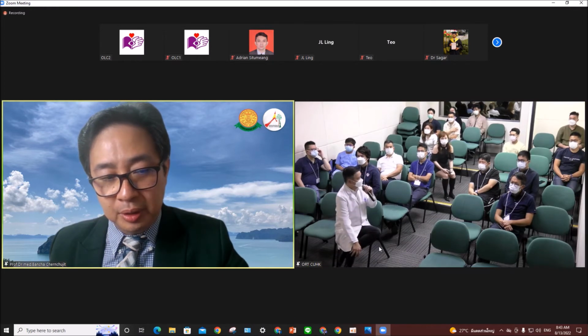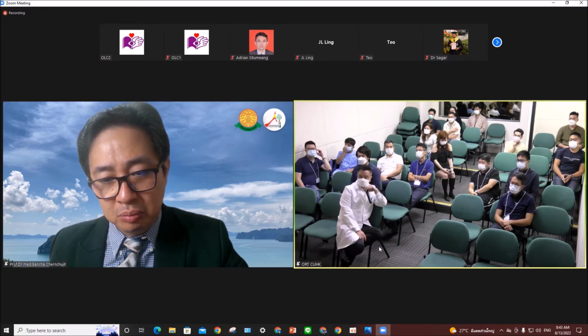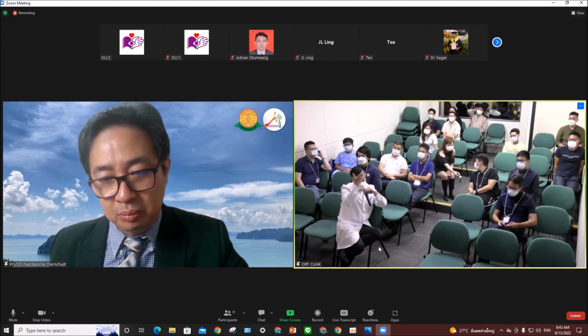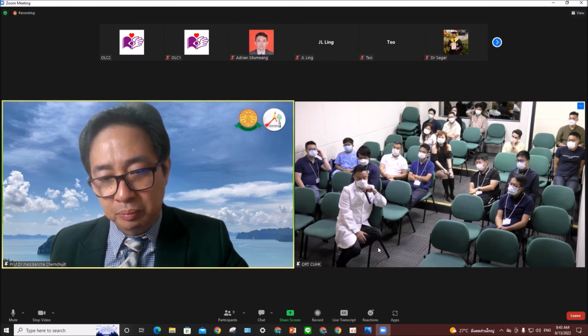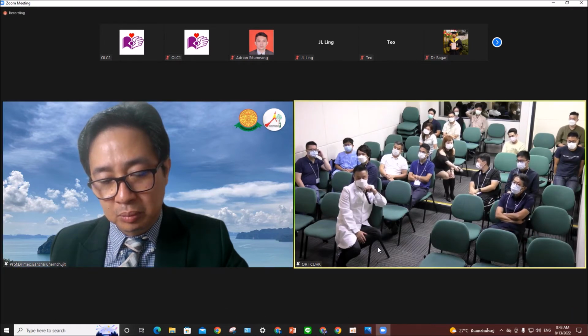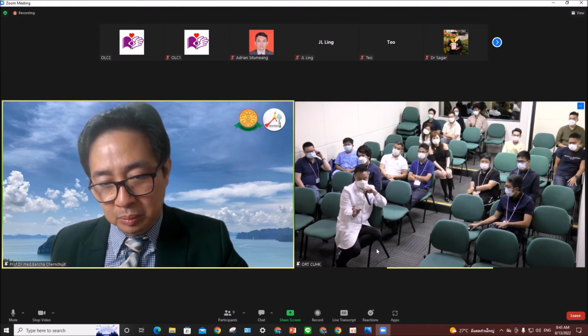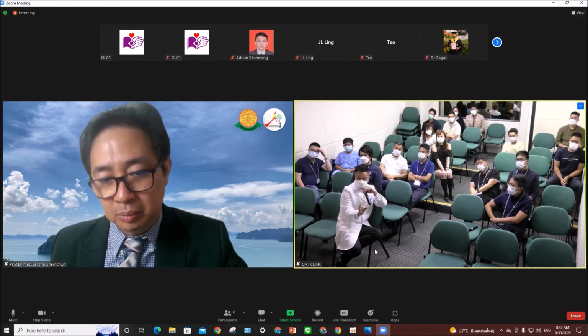How about your idea, Patrick, about the chronic case? I think let's give it a try and see. Fix it, very often. I have encountered really difficult, very fragmented cases. You may not be able to repair the whole fragment, and you debride a lot. The size of the fragment may be reduced, but at least you have the bony fragment with the labrum intact. You fix it back. That will probably be good enough, right?